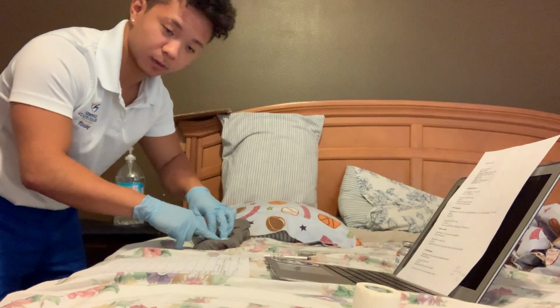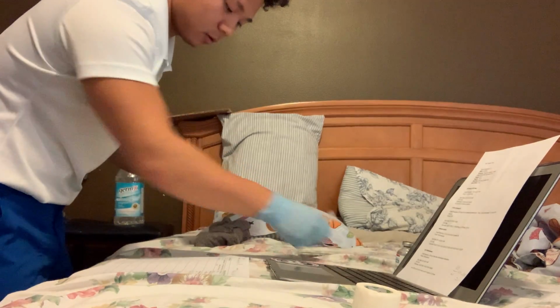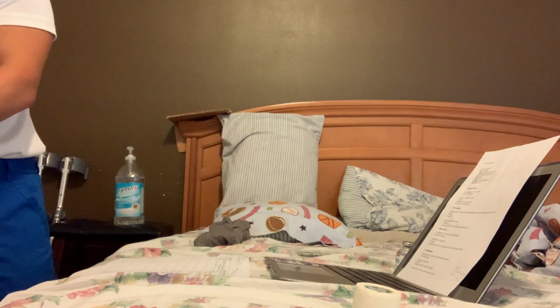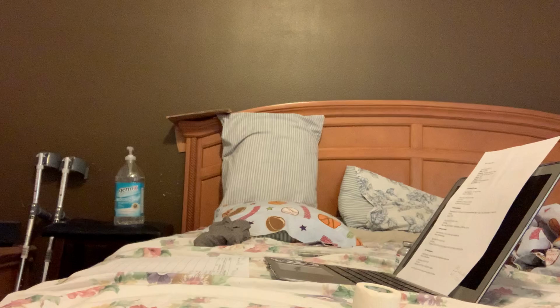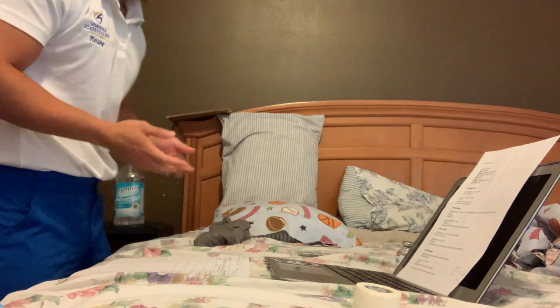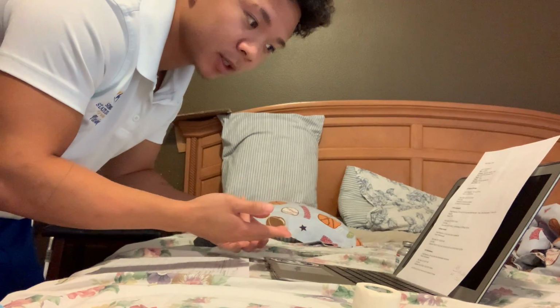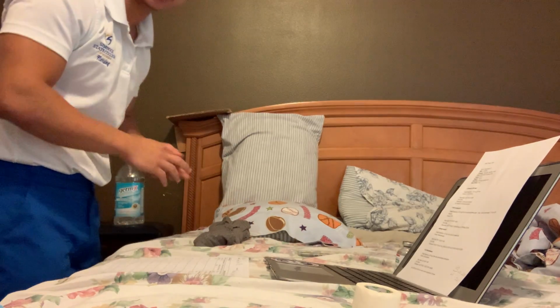And once I get the bleeding to stop, I'm going to dispose all medical equipment into the trash. So we'll do so. And once I've disposed of everything, I'm gonna make sure I document that the medication has been given. I would document any assessments that would have been done, which were the vital signs I've taken.